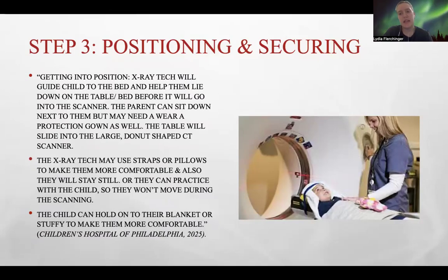If you need a seat belt or pillows to make you comfortable, the technician will make sure that you're lying very, very still. You can hold your stuffy or have your blanket next to you. Then, after everything is secure, the technician will slide you into the large donut hole-shaped CT scanner.